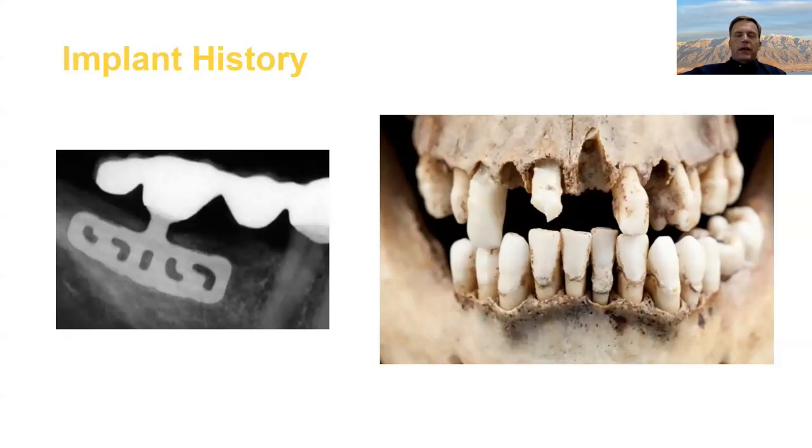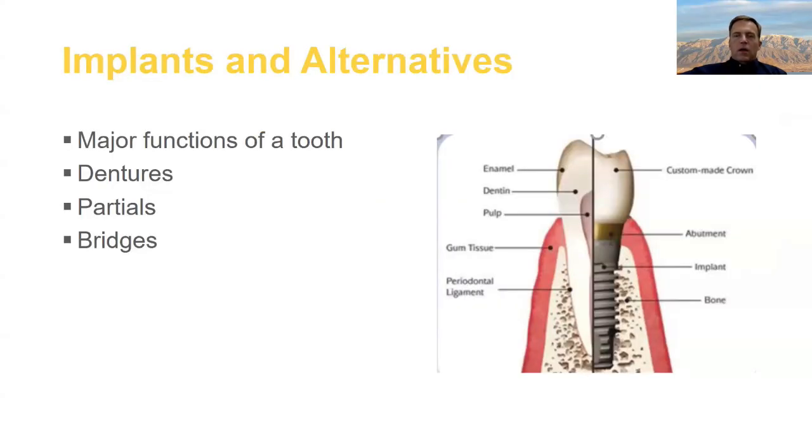So a lot of this other ancient history, there are little bits and pieces that are relevant to what we're talking about, but the implants that we're using today basically are descended from the ones that Dr. Brånemark first developed in 1978. So some of this is a little bit obvious, but bear with me because there's a point to it.